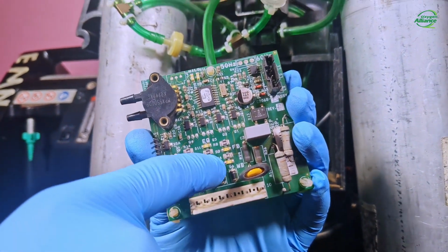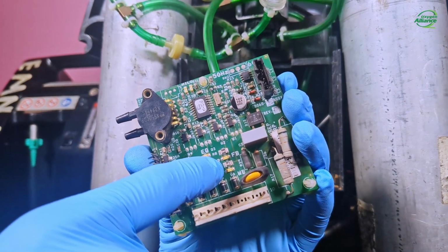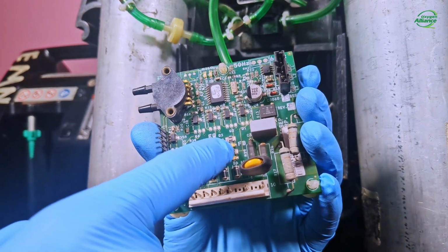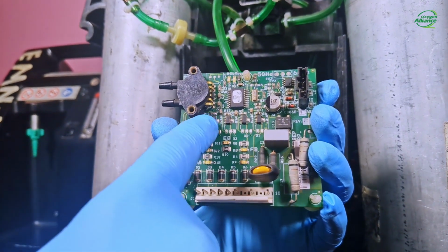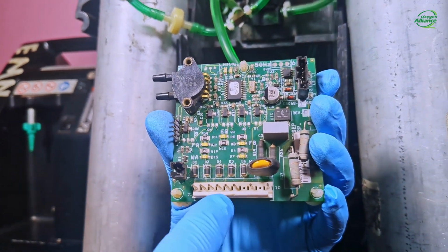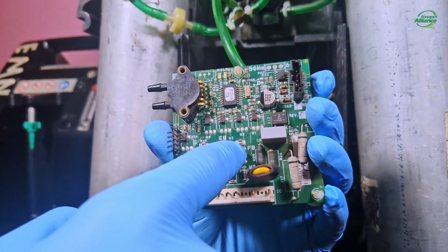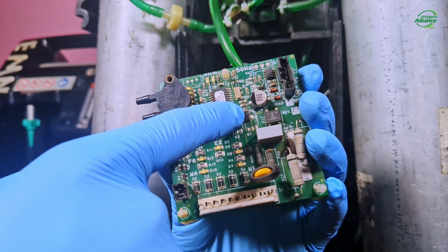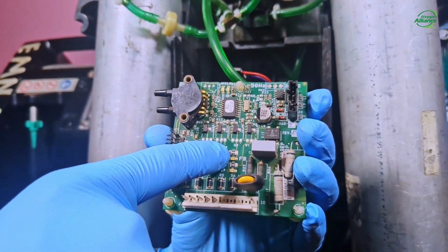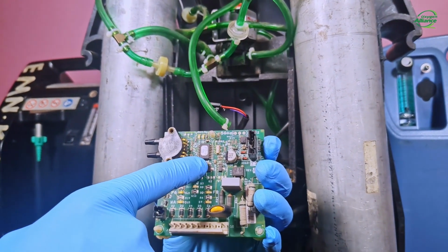So this is the LED that was not lighting up, and on top of it there is its resistor. And if you follow the lines, you have these 5 transistors. So this LED and the resistor are connected to this transistor, and this one on top, the feed valve resistor, is connected to this transistor.